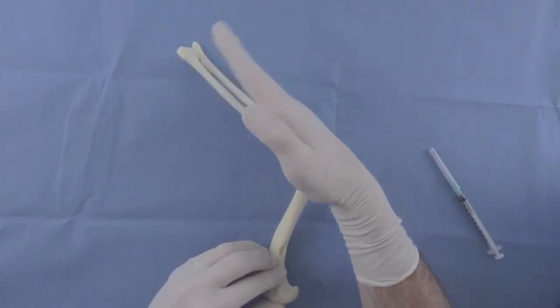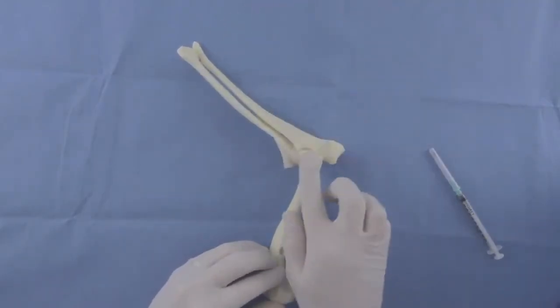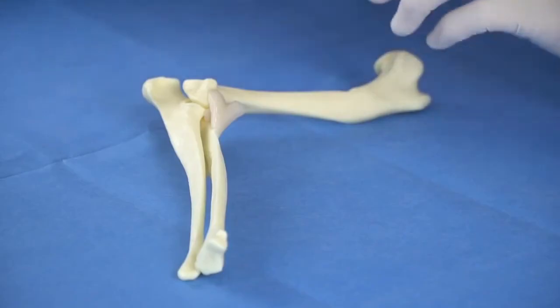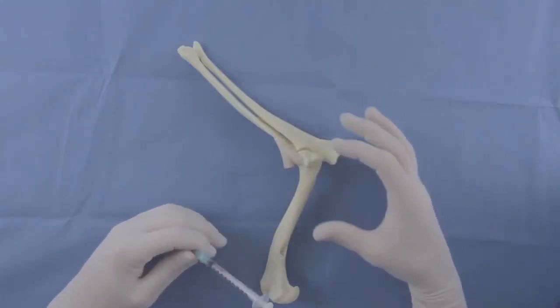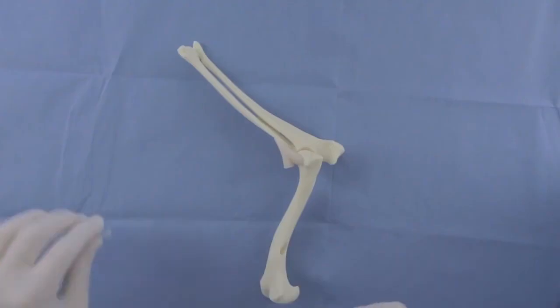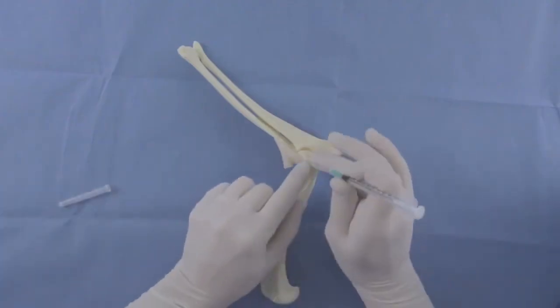Note the direction the humerus is pointing. The injection site is approximately halfway between these lines. The distance between the middle of the epicondyle and the joint space can be easily measured on a lateral radiograph.